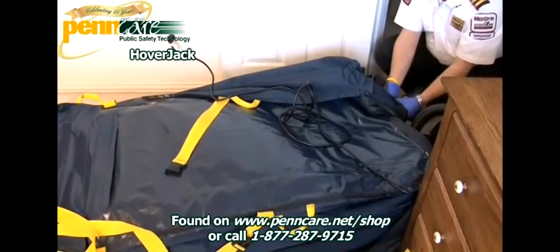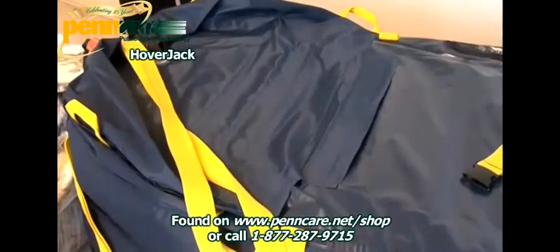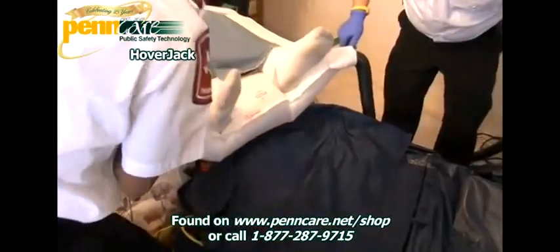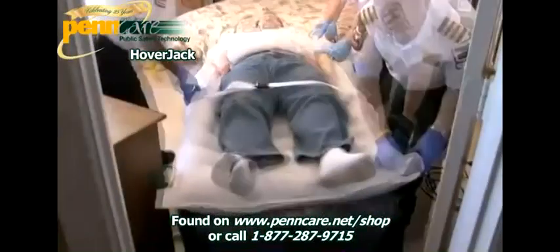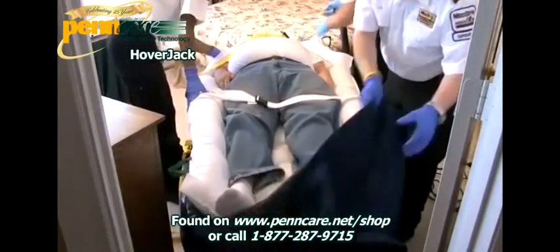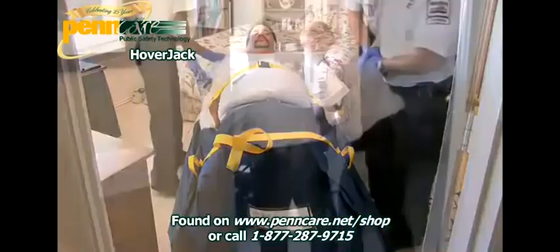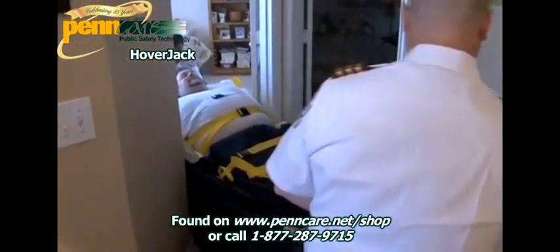With over 25 years in fire and EMS experience, PennCare.net is your trusted source for the best and most dependable emergency medical solutions available online and over the phone. With a wide selection of bariatric patient transfer solutions to choose from at fair prices, PennCare.net aims to get you, the provider, the tools you need to provide reliable critical care for your patients when they need it most. Please visit us at PennCare.net/shop or dial 1-877-287-9715 today.